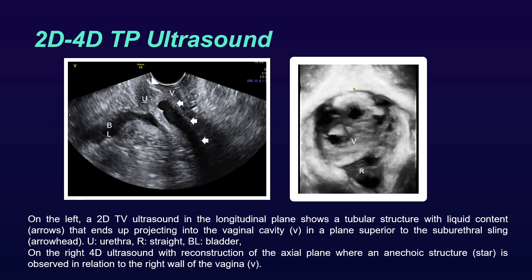On the picture on the left, we can see a 2D Transvaginal Ultrasound in the longitudinal plane showing a tubular structure with liquid content, marked with arrows, that ends up projecting into the vaginal cavity in a plane superior to the suburethral sling, marked with an arrowhead. On the right, a 4D ultrasound with reconstruction of the axial plane where an anechoic structure marked with a star is observed in relation to the right wall of the vagina.